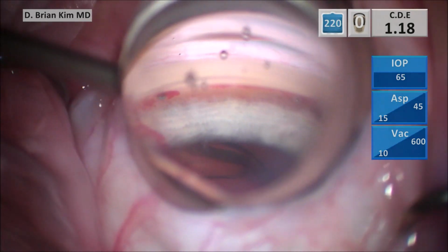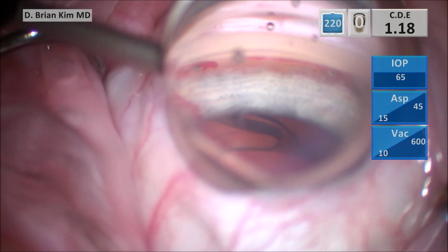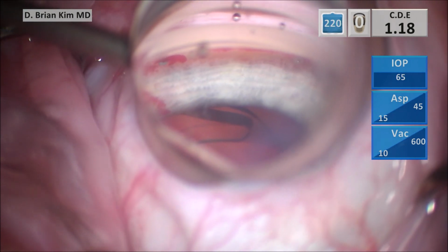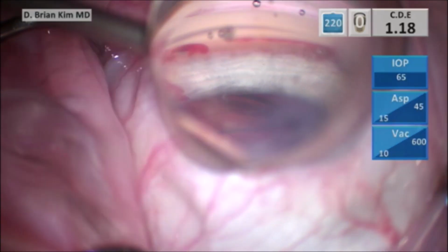So the first pearl is to make sure that the first stent is placed as far to the left as possible while staying perpendicular to the trabecular meshwork, having a nice view of the window, making sure the trocar is central when you fire the device. And then to approach the second stent, you want to make sure you come out. You want to rotate the microscope so it's pointed more towards the right. You want to shimmy your chair towards the left. Go back in. You want to rotate your hands in such a way that instead of a translational movement towards the right side of the trabecular meshwork, you're going to rotate within the incision. And by doing it that way, you're able to point the tip more towards the right, as well as pointing it in a more perpendicular orientation to the trabecular meshwork.